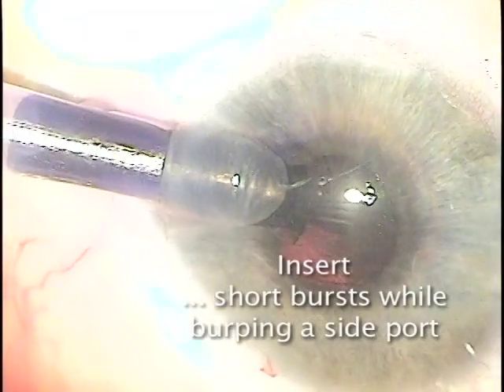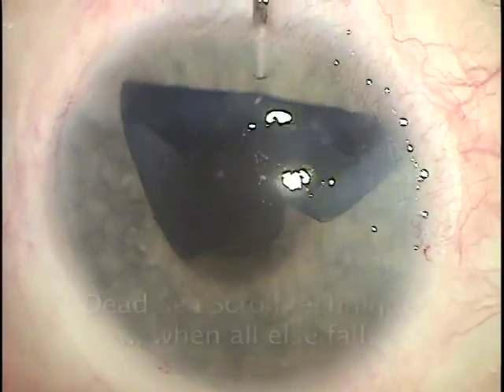We'll start with insertion and load the membrane into the tip, then inject it with short, quick bursts, being sure to keep an instrument in the side port to avoid the torpedo effect.